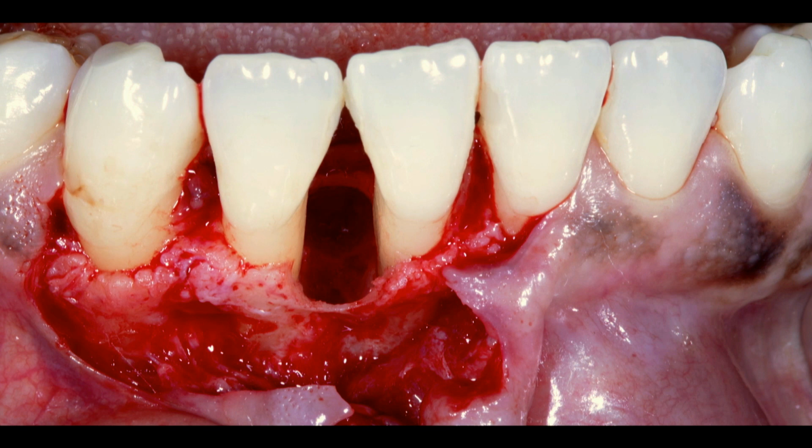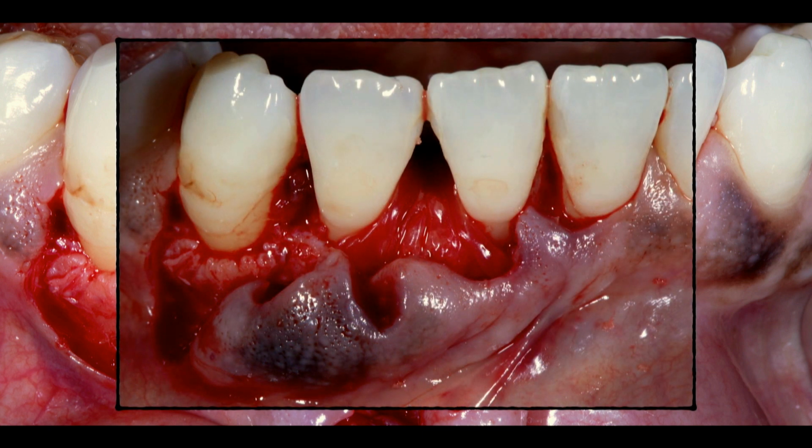But what you can see here, obviously, very, very narrow interdental spaces. We do have a defect in the lingual wall, but we do have the marginal bone intact. Okay, so in this case, just like John mentioned, we're going to clean this as well as we can. We're going to plane those roots. And one of the things I love about BioXclude is I can put that onto the root surfaces as well. I can use that. It's got all the growth factors that I want. And what could be easier than adapting this interproximally? There's no trimming of the membrane needed.